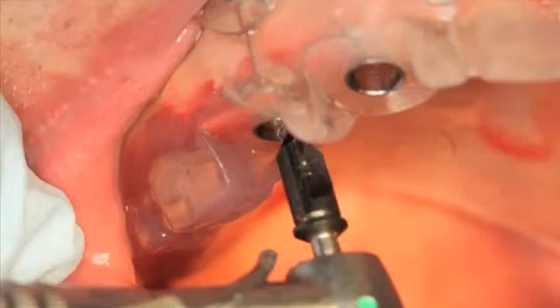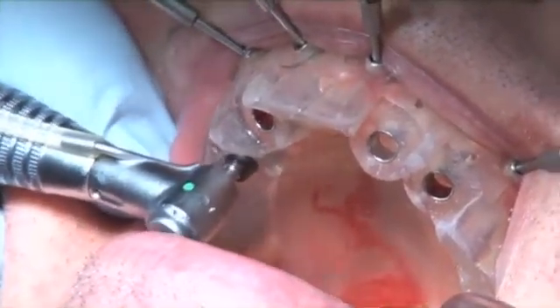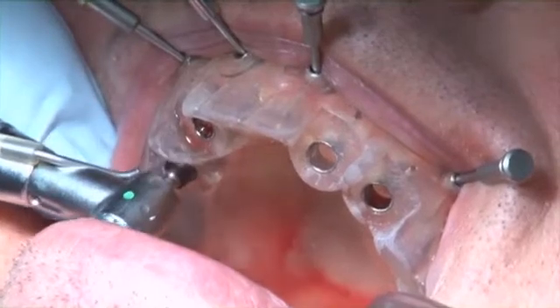Figure 13 and Video 3 show the use of a tissue punch, which is used to remove soft tissue from the surgical site, preventing any possible contamination of the osteotomy. This drill does not require a drill key, as the opening in the surgical guide is the same diameter as the final predetermined implant body.